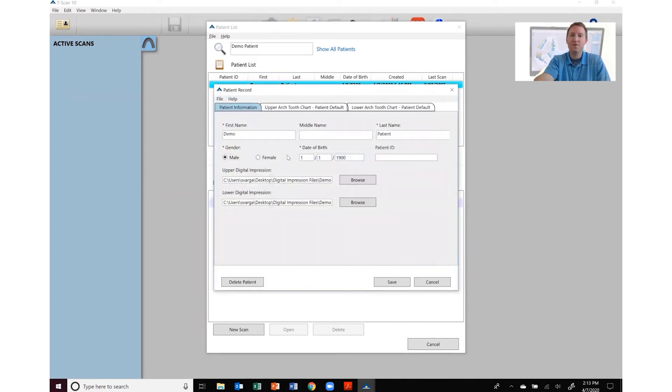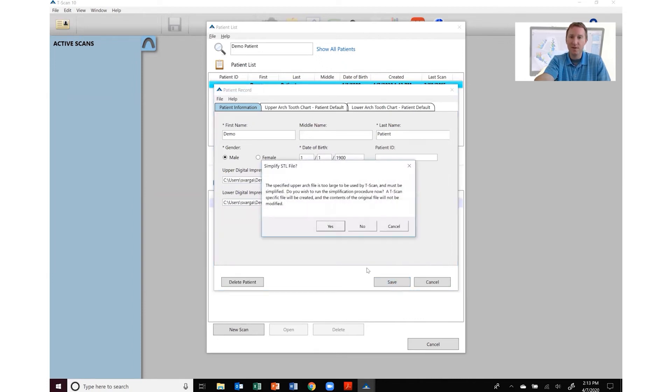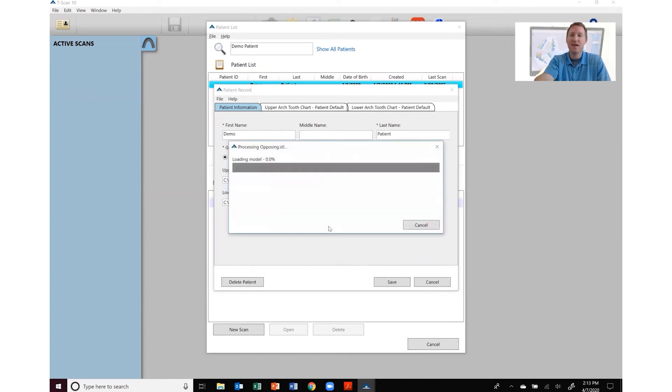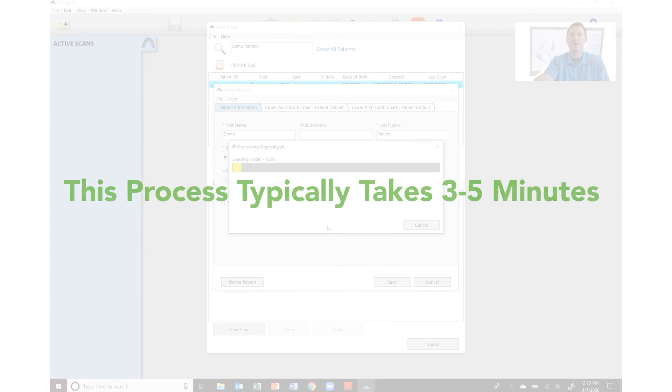Once you locate the files you can now hit save and then Tscan is going to go through its process to minimize the size of the file. All you're going to do here is click yes and let Tscan go through this process.